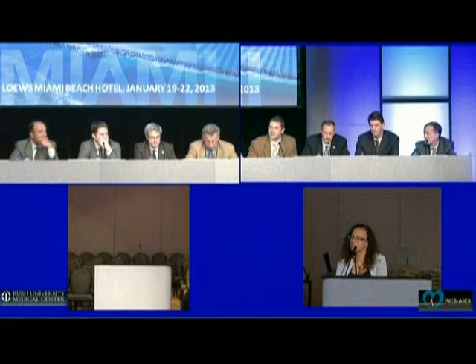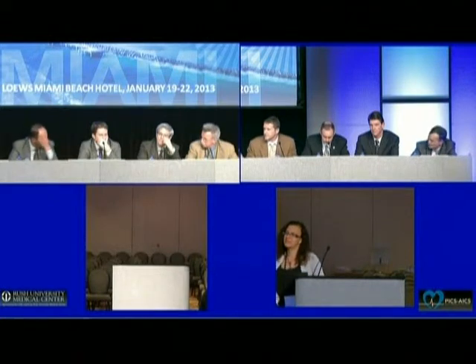The big advancement for us, and we stole it right out of the EP literature where they looked at left atriums years before we got this, was rapid pacing. Rapid pacing and slowing down the transit time really allowed us to come way down on our dye load and get good image quality. Just about all the images I showed were significantly diluted contrast. And so again, I think you can do this. We all started with probably higher contrast loads, but you work your way down as you get comfortable with the technology. It also depends on what kind of acquisition you're interested in.